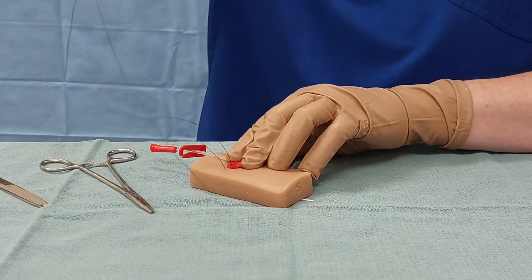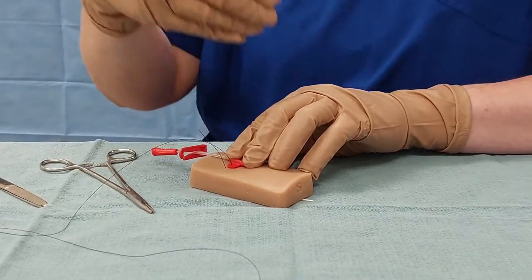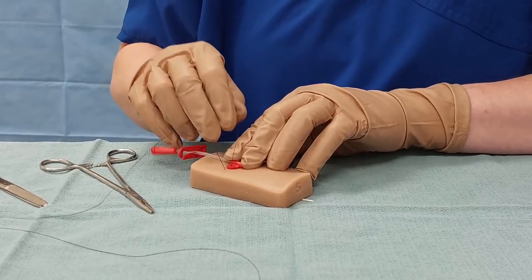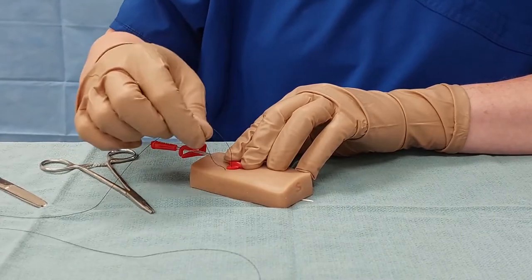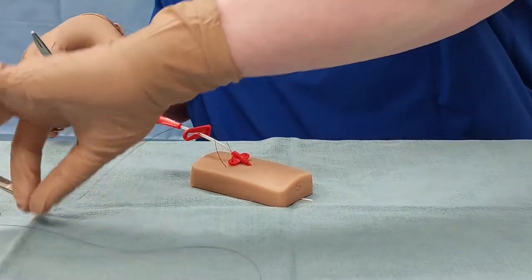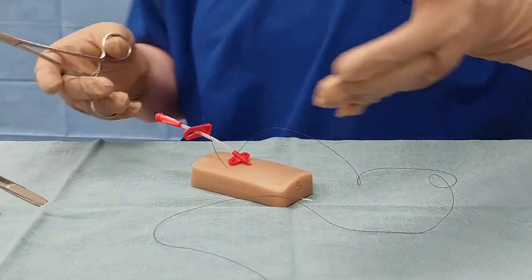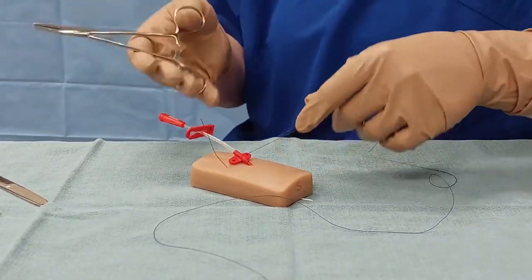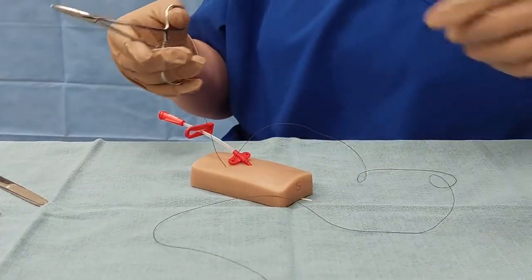Now I'm going to pull the thread through until I have somewhere in the neighborhood of a four to five centimeter tail. You don't want it to be too long, but if you pull it too short, you risk pulling your suture all the way through. Your body position can vary a little bit, but it's generally easier if you can make yourself as perpendicular to that as possible so that your hands stay on the same side.